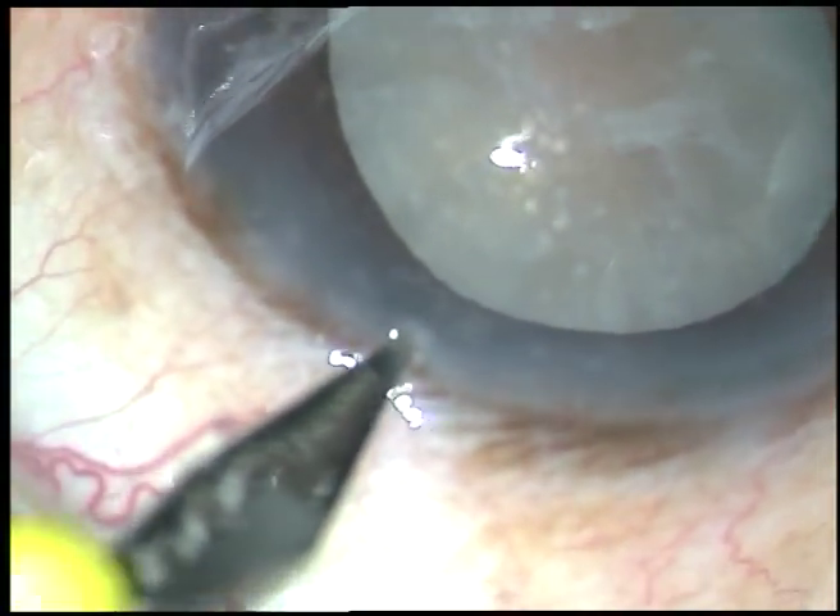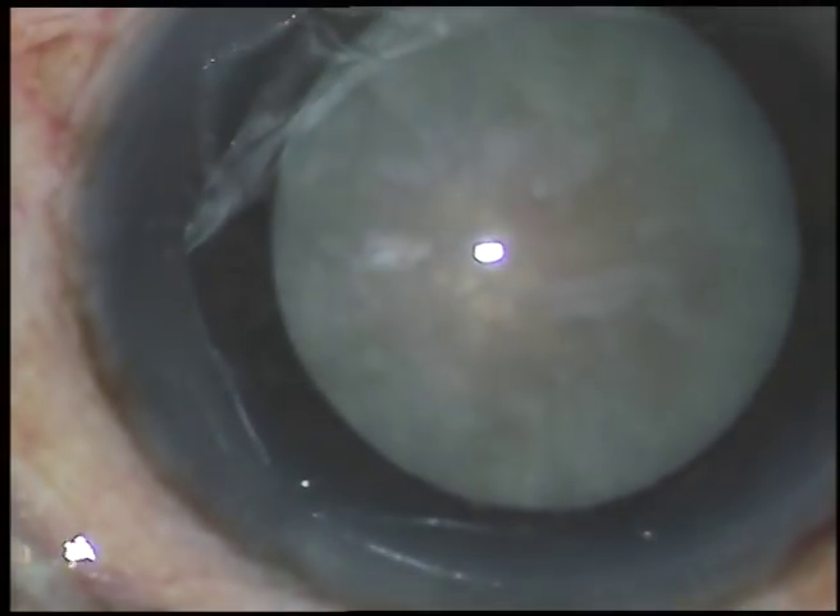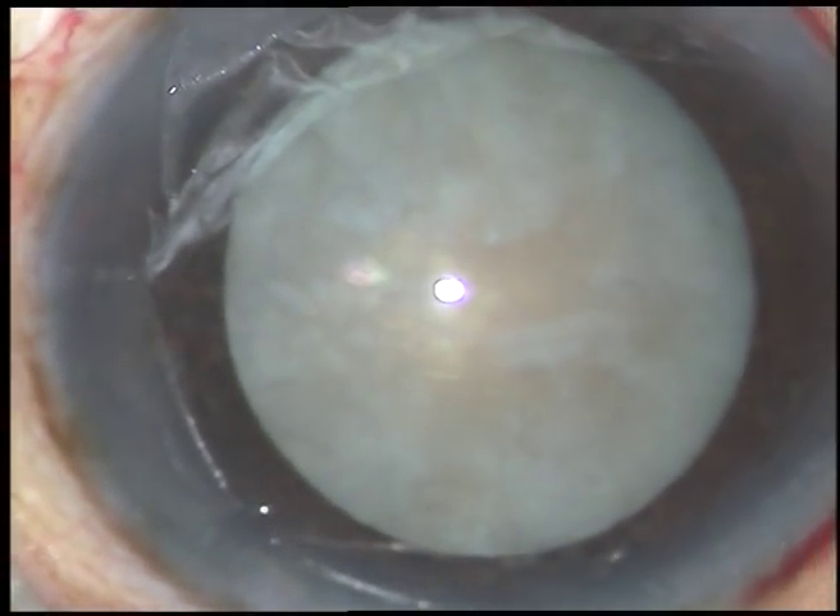And now, this is another side port on the left side, the same distance away from the main incision.